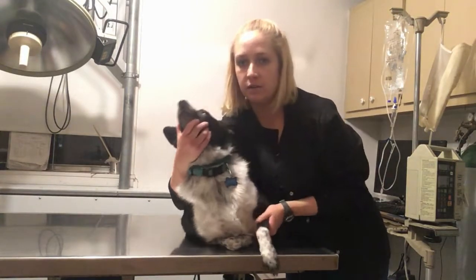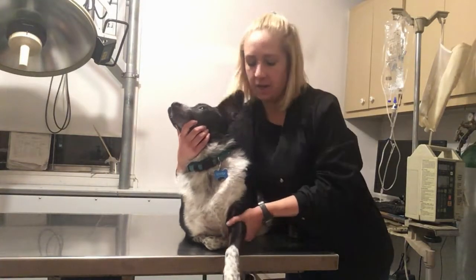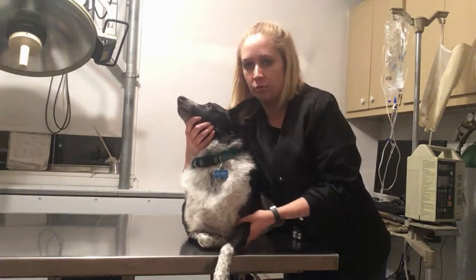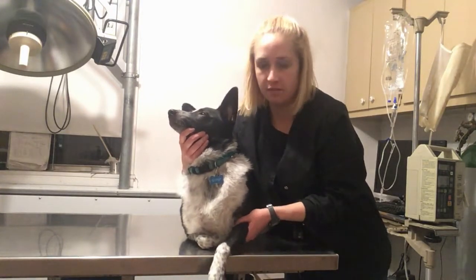So you're going to go ahead and hold on to the head, and then you're going to take, with your 2 fingers, take control behind the elbow, and then you're going to use your thumb and roll the cephalic vein and hold off really tightly.